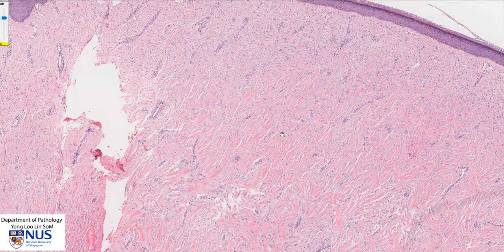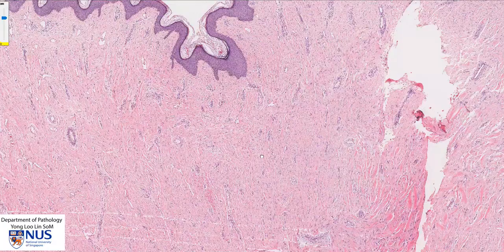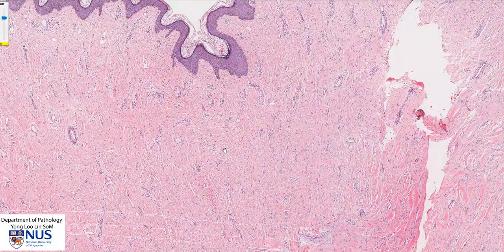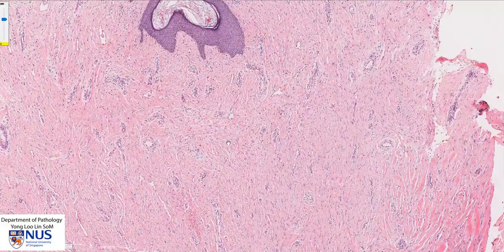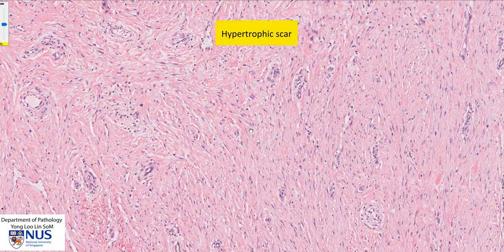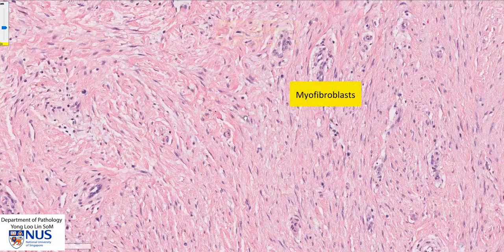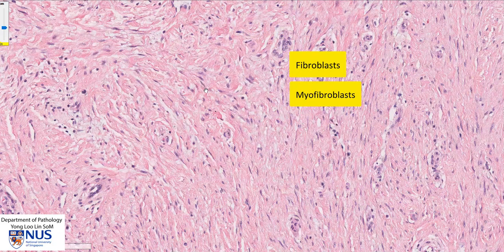While these ropey bundles are present in some areas, in other areas we don't really see that very pink appearance. Instead, we see hypertrophic scar tissue formation where there are lots of myofibroblasts — these spindly cells — and also fibroblasts, which are very spindly cells that lay down collagen.